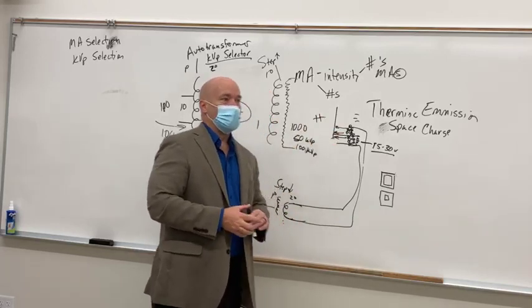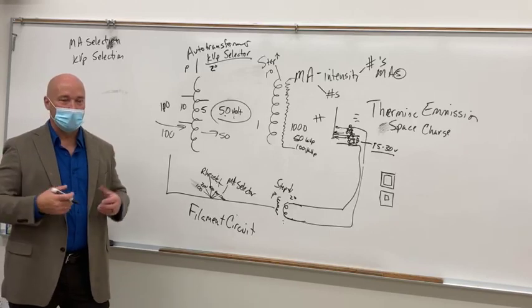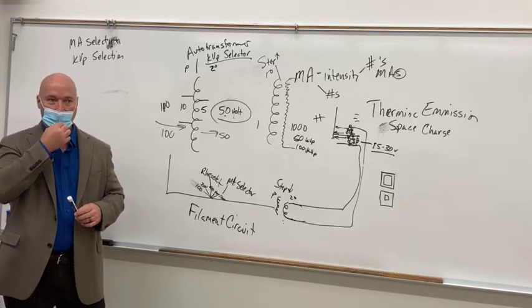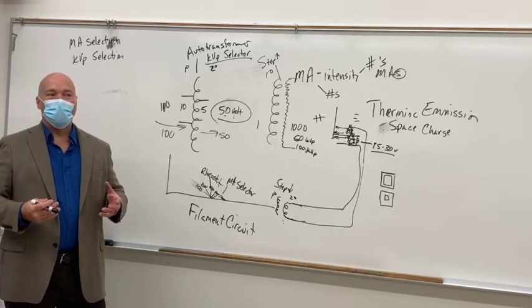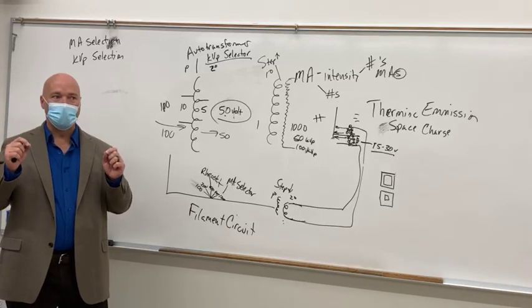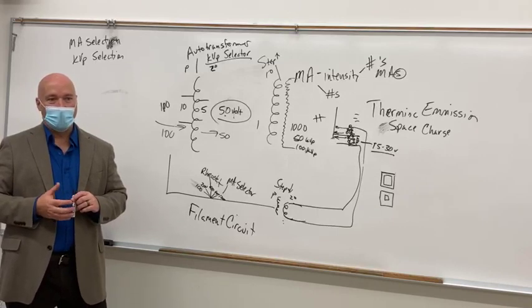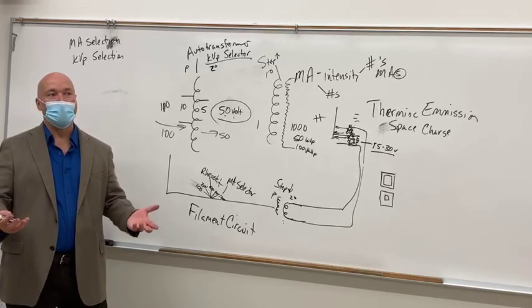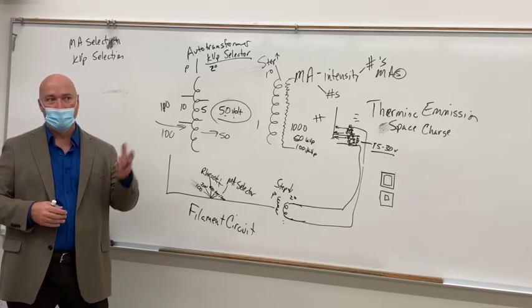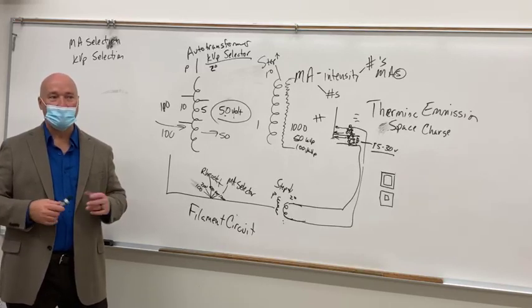Again, looking at the chest X-ray, you've got certain detail that you want to see there. You want to see the lung markings, you want to see the edge of the ribs, but you've got big anatomy there, right? So how important is it to see just the finest little bitty piece of anatomy on that X-ray? Not very. We don't want to miss a diagnosis, but in as much as we need to see trabecular markings, what are we looking at there? The lungs. The lungs, right. Do we need to see trabecular marking?